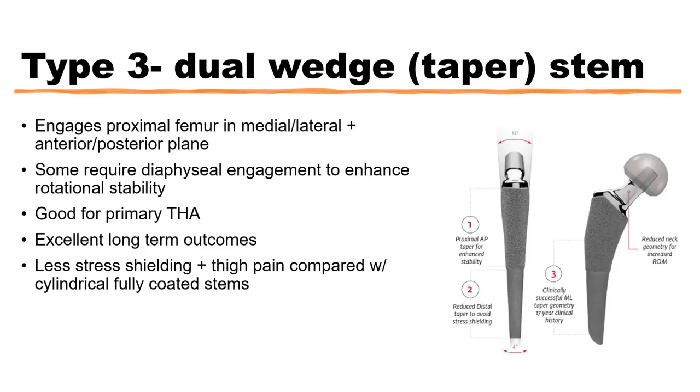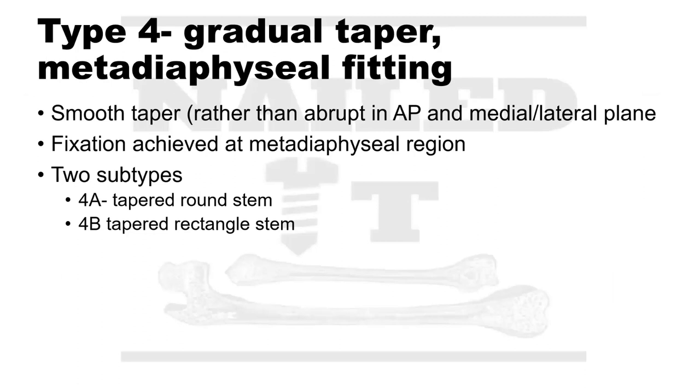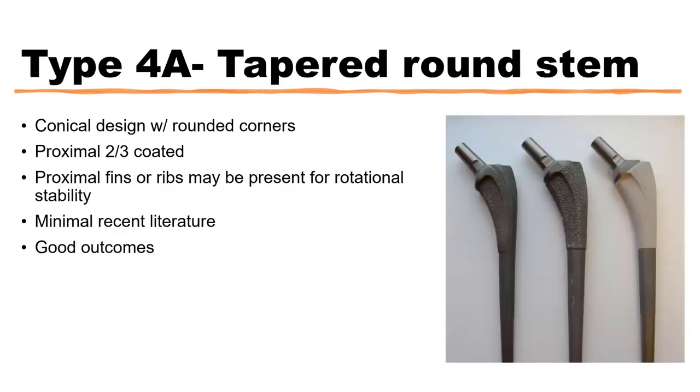Okay. Moving forward, we talked about the single wedge and the dual wedge, which were type 2 and type 3 respectively. What are our type 4 stems, or how would you describe them? I would describe them how you can read about it in the paper. It's just a different kind of design. We don't usually use that as much in this country. It helps you look cool reading other x-rays. It's proximally porous coated. They have various different designs that you'll see out there. Some of them have fins or ribs to help with rotational stability, but it's more of a curiosity when you look at x-rays. Most of the residents on here are probably going to be using the type twos or threes for your primary total hips.